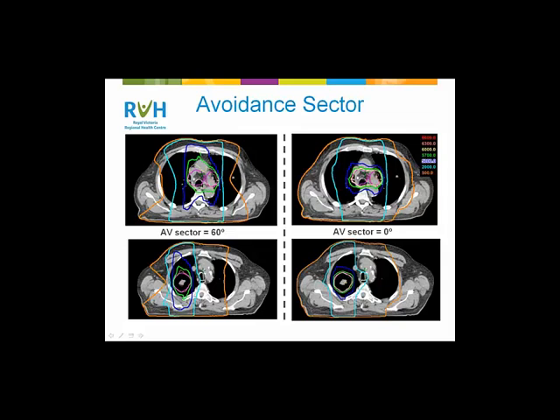What we find is that the gantry speed is fairly constant, even when we have just the partial arc and no base field. And it doesn't realize that it should push more dose through those angles. So again, like our restricted arc, we have to help the optimization out a little bit by doing the base fields. But there's also two other big benefits to the base fields, and that's the motion interplay mitigation that you get by having the static open field. And to go back to the 18 MV thing, there is a little benefit in having that second energy available for the base fields, because you can get a little dose to the cord when you're putting beam through in that APPA geometry.